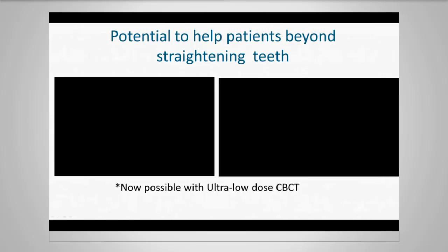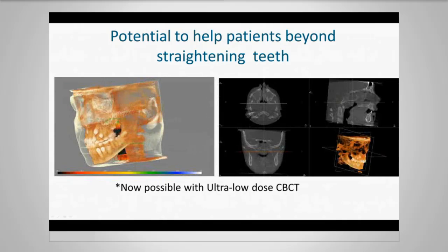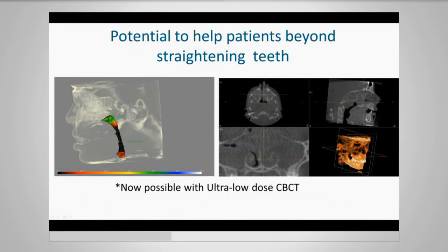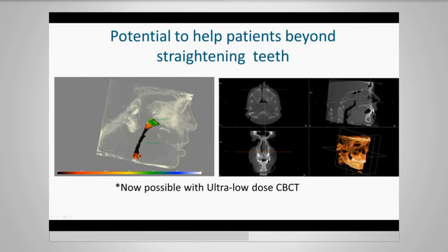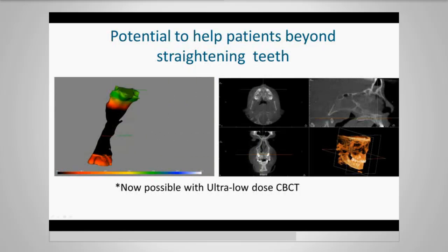We look at the big picture. It really becomes our responsibility now and our obligation to understand patients' airway health and manage and develop their airways as part of our overall evaluation. So every single patient in our practice gets an entire cross-sectional view, these multiplanar views. We want to understand their complete anatomy.